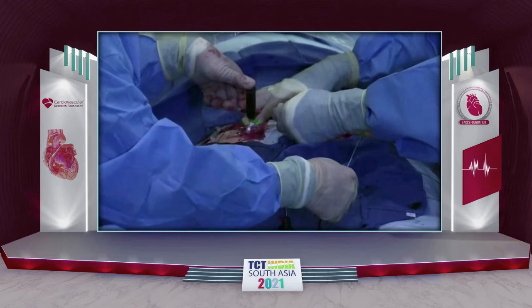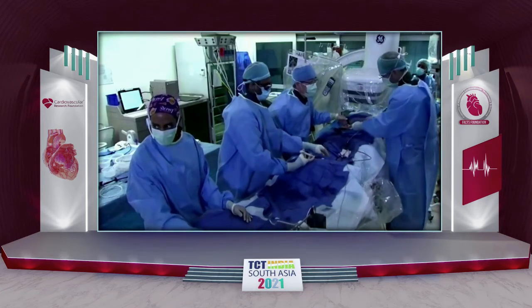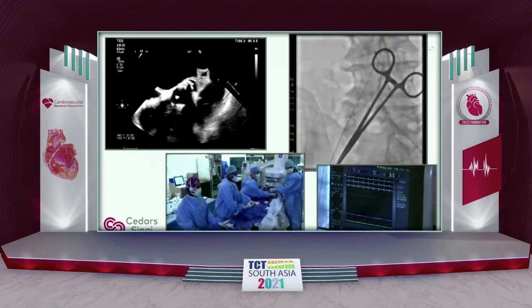So now I think the other room is also ready. We are down here, and it looks to me like hemostasis is successful. We'll just make sure with one contrast injection. Can you just perform that please here? Do you reverse with protamine before you remove the sheath, or you don't? I usually make sure that there's no occlusion in the artery. But I think in this one, we can give protamine. Test that.